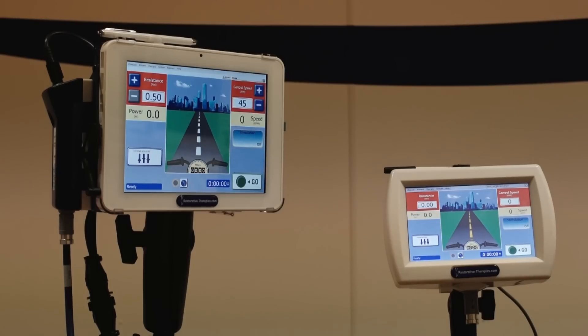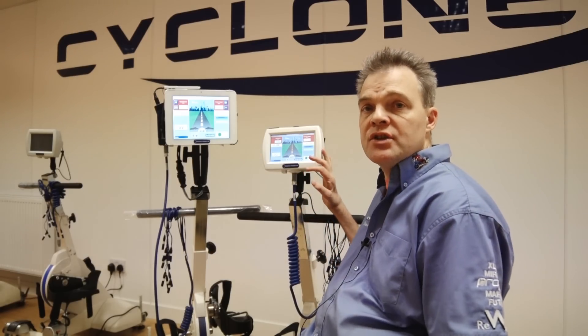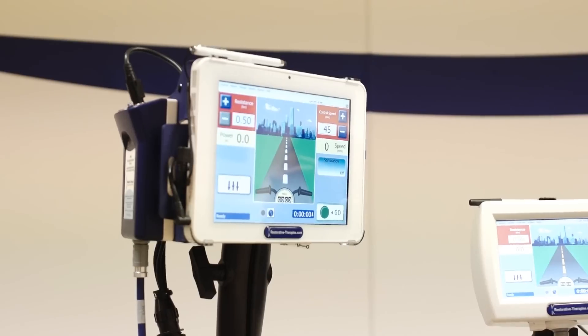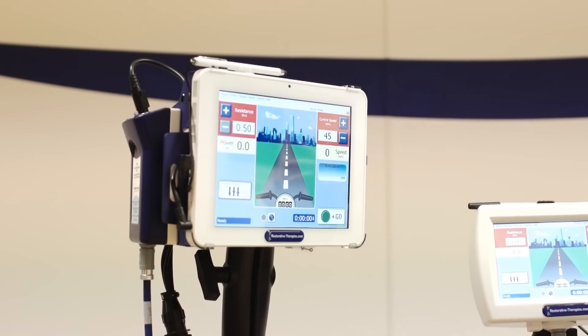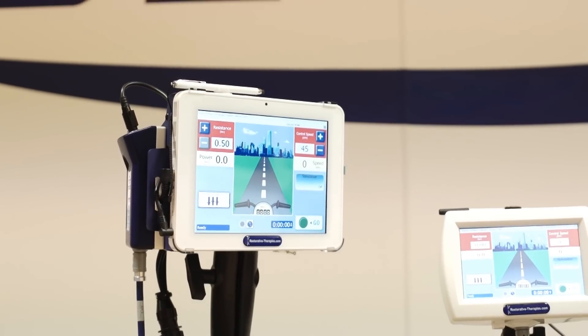Hi, I'm Stuart and this is Carl, and today we're going to talk to you about some exciting news we've got from Restorative Therapies. What we have in front of us here today is the old Sage 7 and the new Sage 10. From now on, all of the RT200 and RT300s are going to have this tablet-based technology.